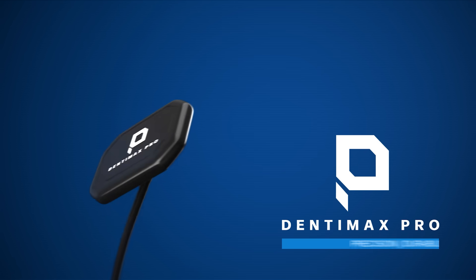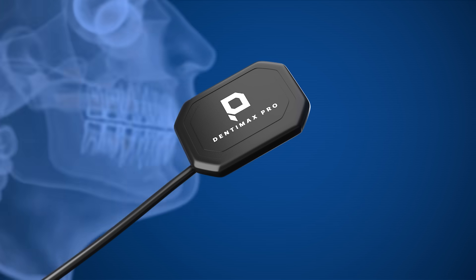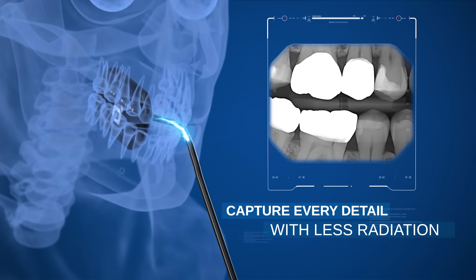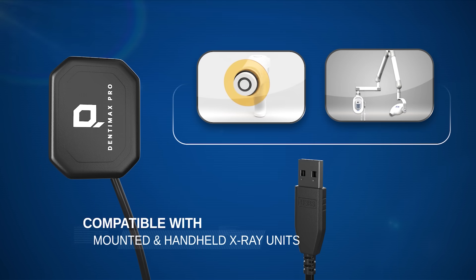Introducing the Dentimax Pro Sensor — precision, durability, and patient comfort in one sensor. Our advanced CMOS technology delivers exceptional detail with minimal exposure. Compatible with wall-mounted and handheld X-ray units for seamless flexibility in your workflow.